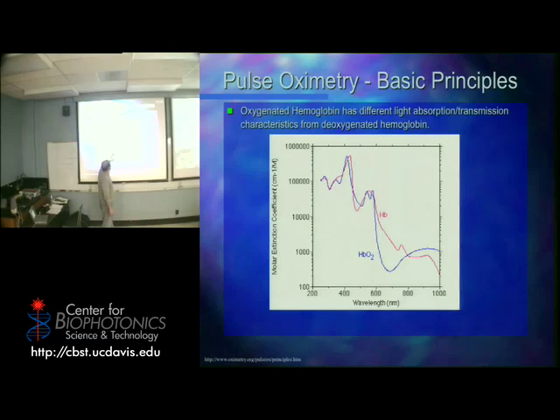Now, what you notice is over here there's a lot of overlap. But there's a nice clear difference here, right? And there's some difference here. What region is this? Okay, what part of infrared? Near, far, mid? Near infrared. Your TV remote control is smack dab right here. This is the wavelength that your TV remote control uses, around 925, 950.